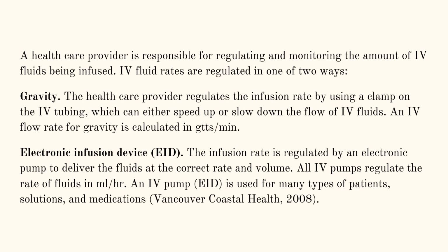Electronic infusion device, or an EID. The infusion rate is regulated by an electronic pump to deliver the fluids at a correct rate and volume. All IV pumps regulate the rate of fluids in mLs per hour. An IV pump is used for many types of patients, solutions, and medications. It's what you will see 95% of the time, if not more.